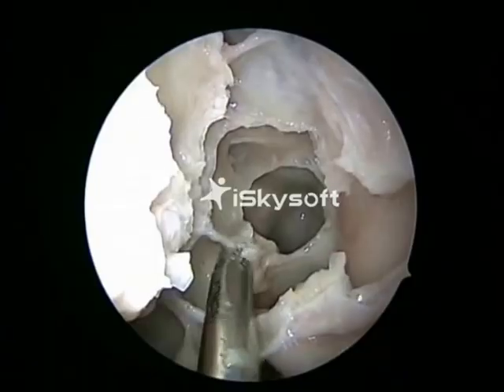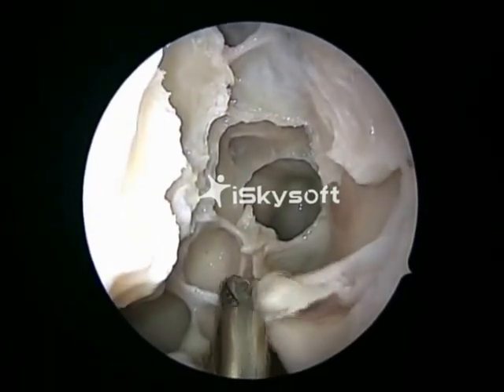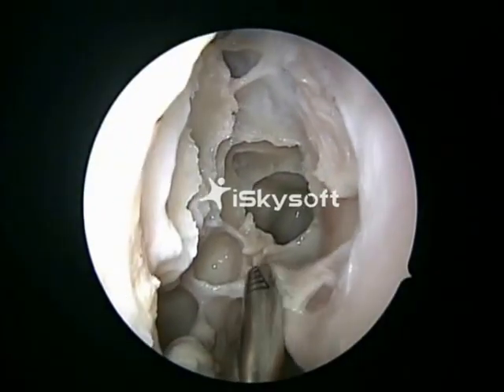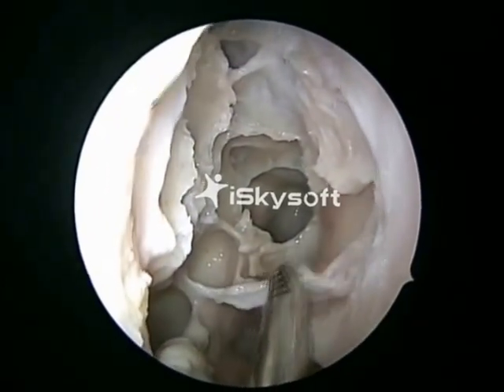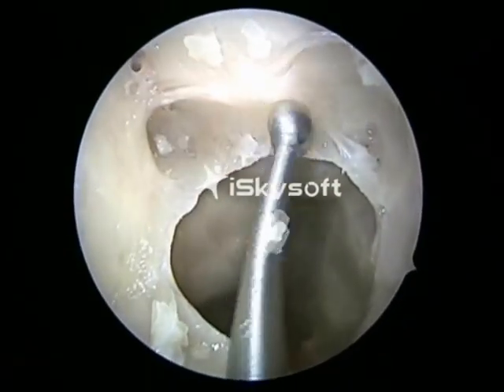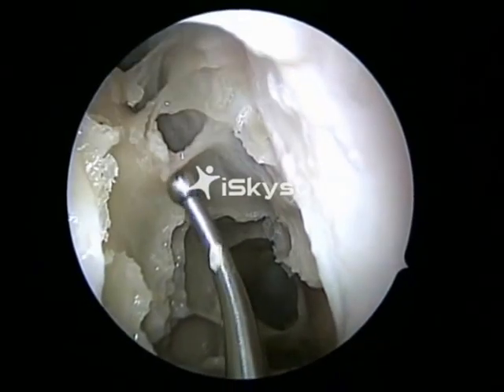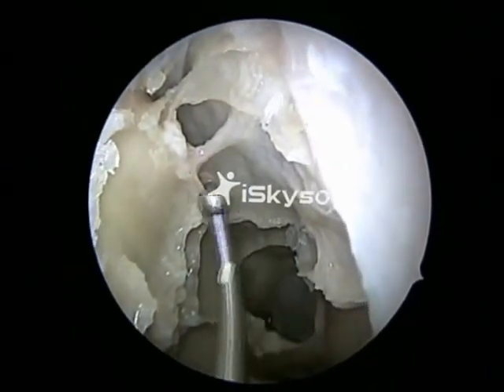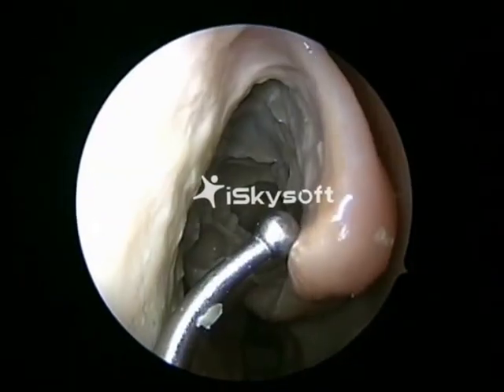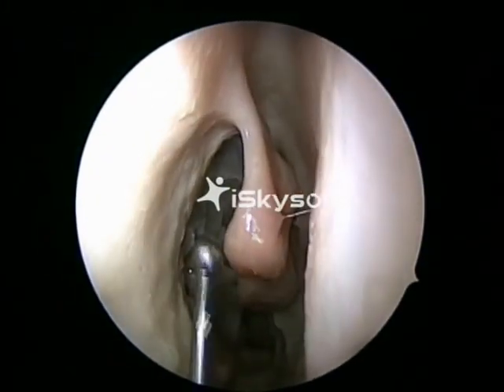Now, we trim off all the bony spicules, and at the end of the procedure, we should have a smooth looking cavity without any bony spicules hanging down. That's the final result we'll have to achieve after a total sphenoethmoidectomy. That's a skull base, that's a posterior skull base, that's the anterior ethmoidal artery, that's a remnant superior turbinate, the middle turbinate very stable in your picture.